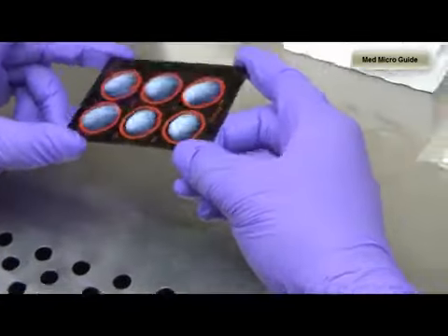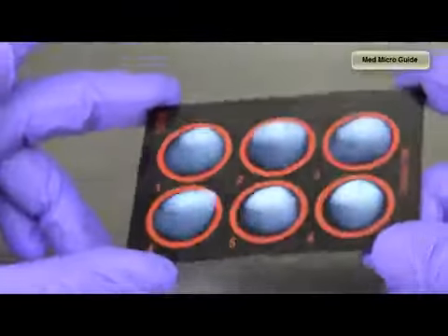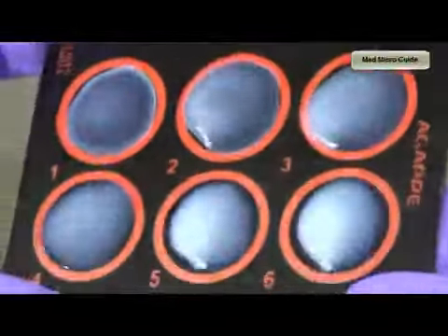After mixing, we will gently rock the slide to and fro for 2 minutes. This will lead to the agglutination of streptolysin O coated latex particles with the ASO antibodies which are present in the patient serum. Now you can appreciate the latex particles agglutinated at 1 in 2, 1 in 4, 1 in 8 and even at 1 in 16.